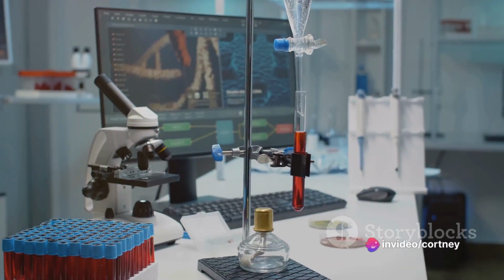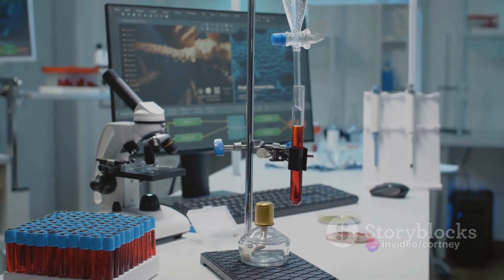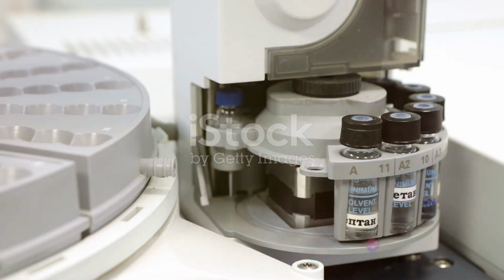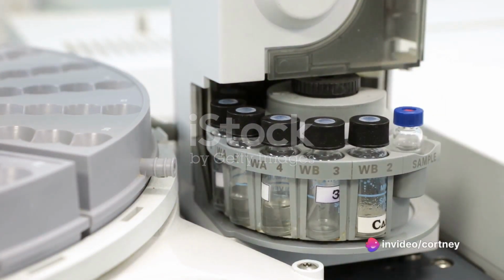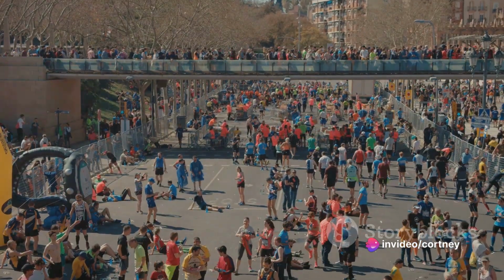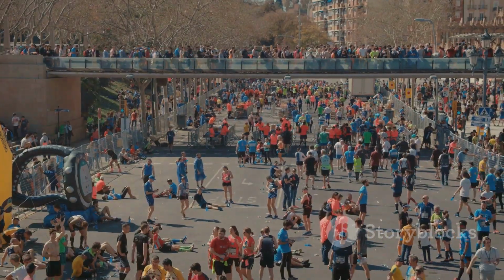It's then carried through the column by an inert gas, much like a gentle wind pushing our runner along the track. As the sample travels, it interacts with the material inside the column, causing different compounds to travel at different speeds. Some compounds, like our faster runners, reach the finish line quicker. Once these compounds cross the finish line, they are detected and analyzed.